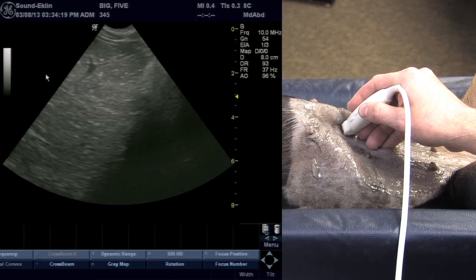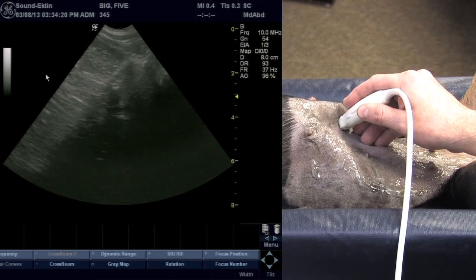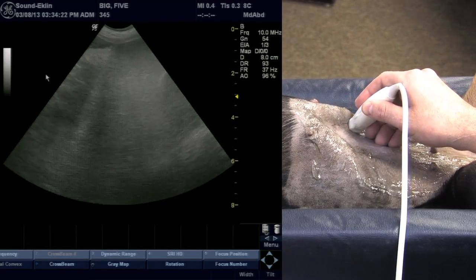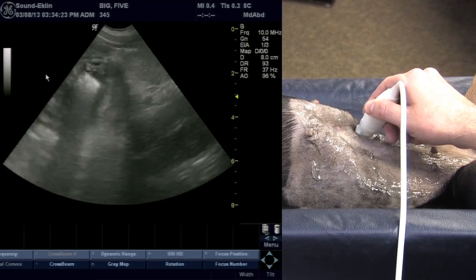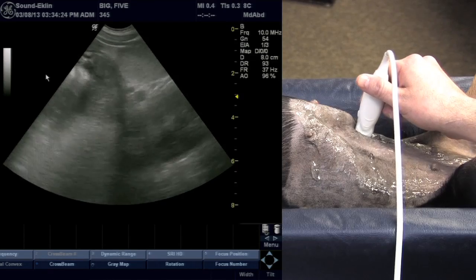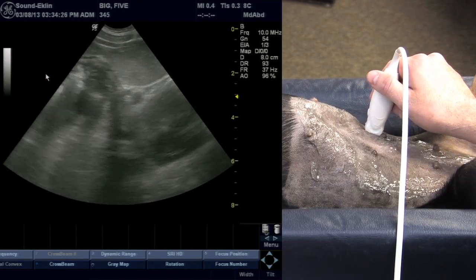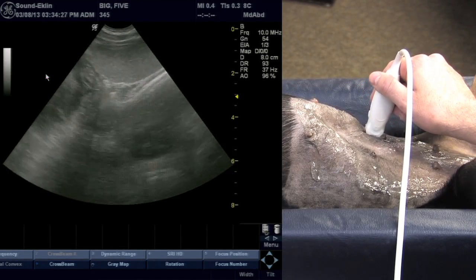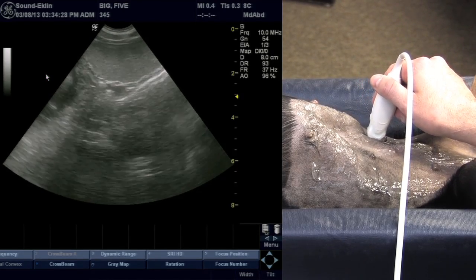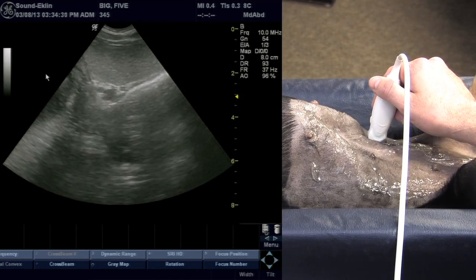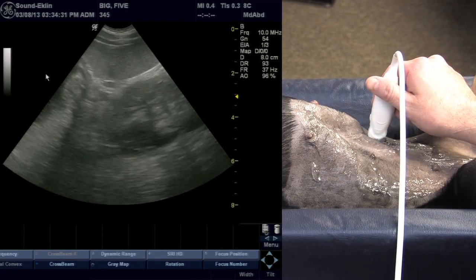As we continue our tour, we're on the left side of the liver again. We're going to slide caudal to that liver and our probe is still in a sagittal plane with the reference point towards the nose, and we'll pick up the spleen.